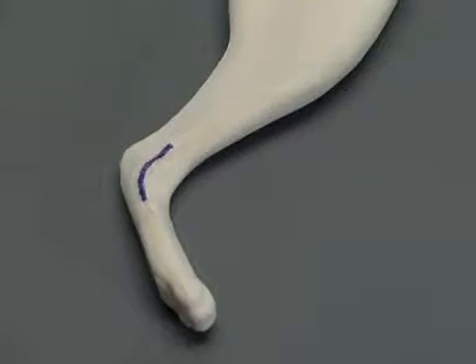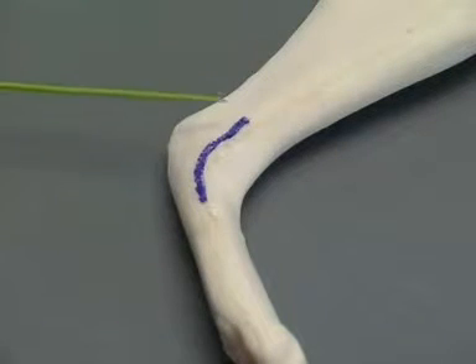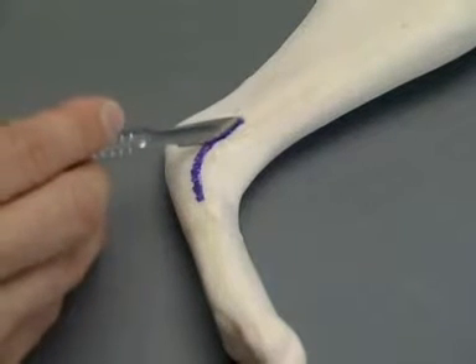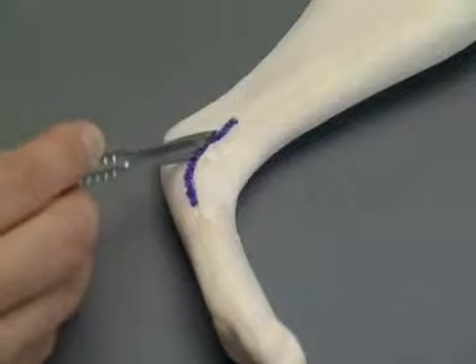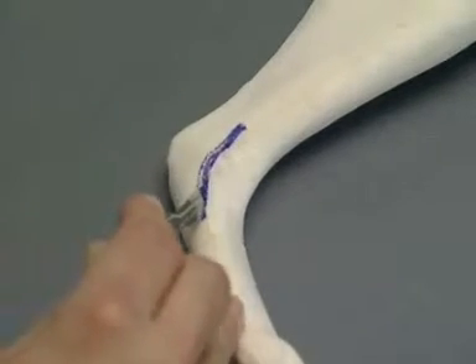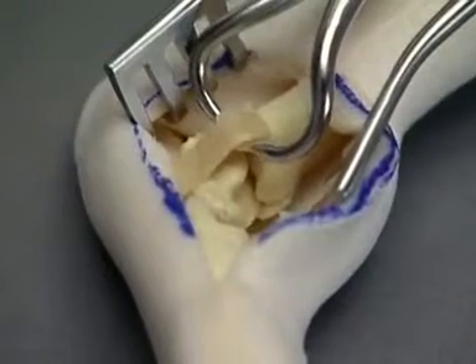The landmarks for the repair of the medial malleolar fracture are the distal tibia and the central tarsal bone. The foam is incised on the medial aspect of the talocrural joint. The fracture is reduced.